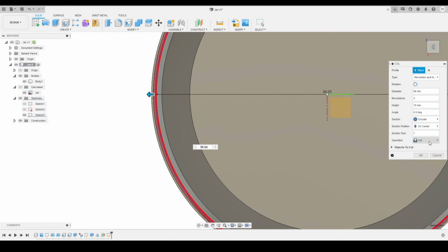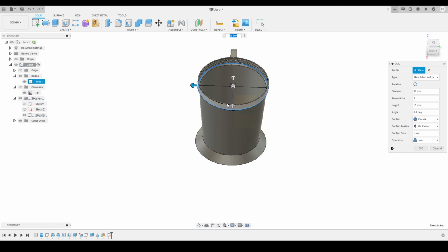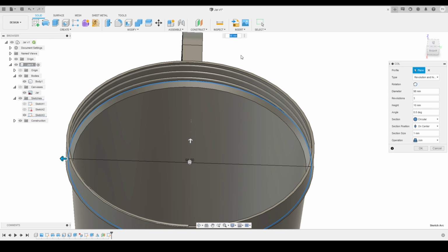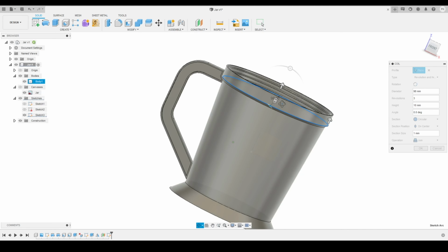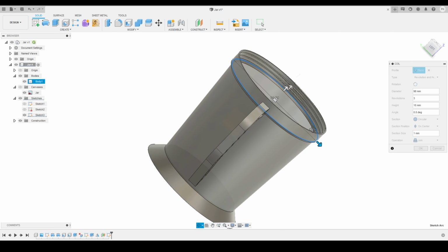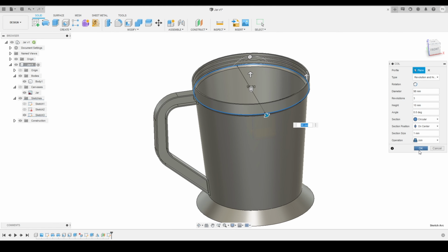So what I'm going to do is, instead of cut, I'm just going to make it a join over here. And now if I orbit it a little bit, here you can see this is the preview of the results we are getting. So I think we need to adjust a few more things over here. So before moving on to that, I will just make sure that the things are all good. So I will just orbit it a little bit and try to see if the things are good, and will press OK if I am happy with the results.